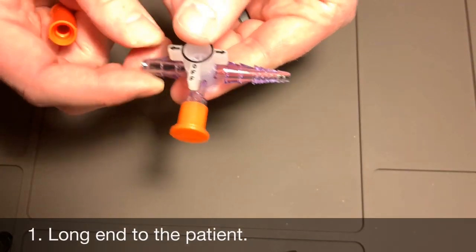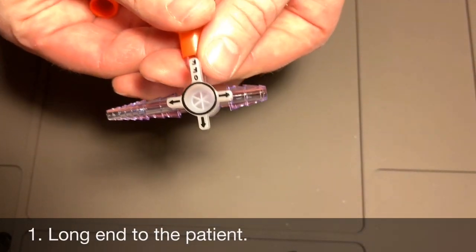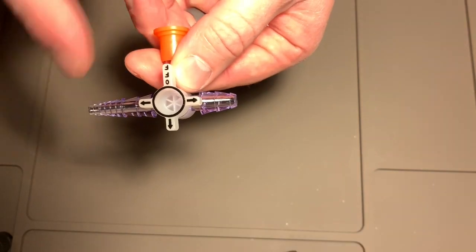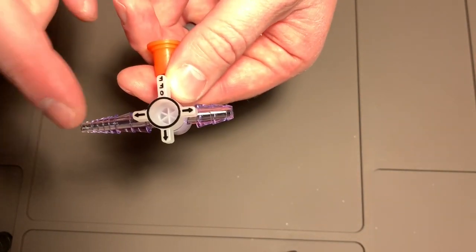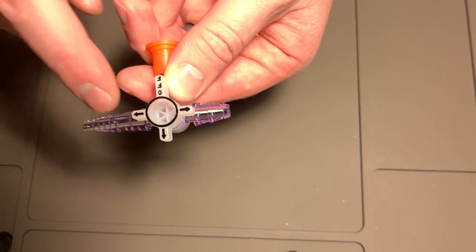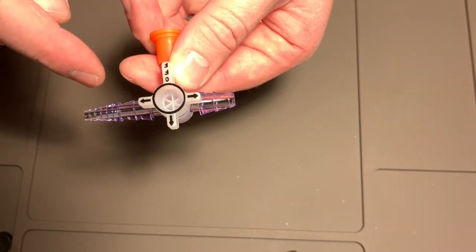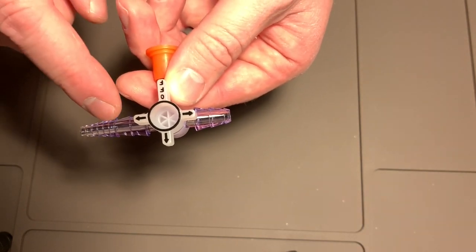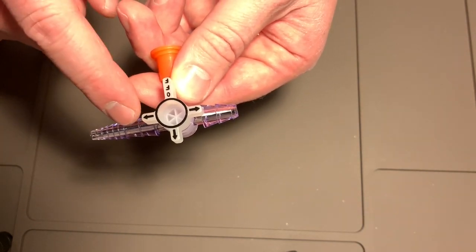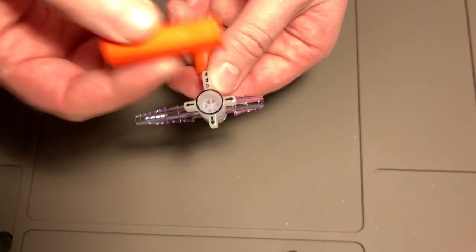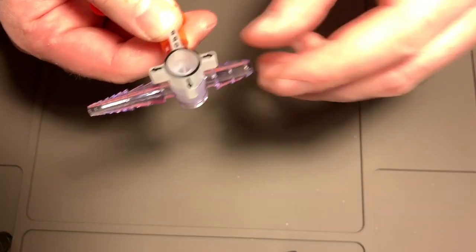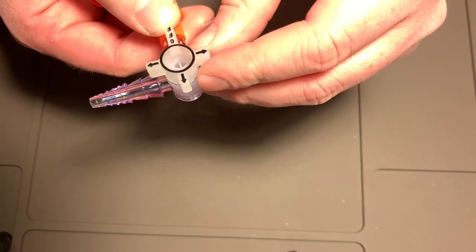Okay, tip number one. As you can see here on the valve, there's a long end and a short end. You want to put the long end into either your NG, OG, Dobhoff, whatever it is that's in the patient. You want to put this long end into that because your connector here, if you're going to hook this to suction, then your suction tubing is going to go right on here.